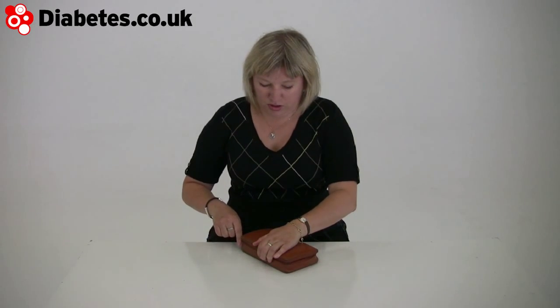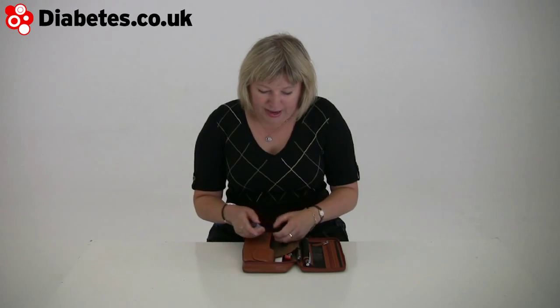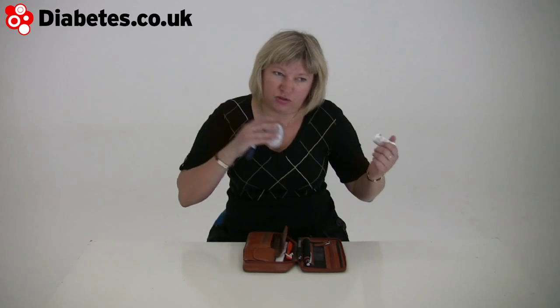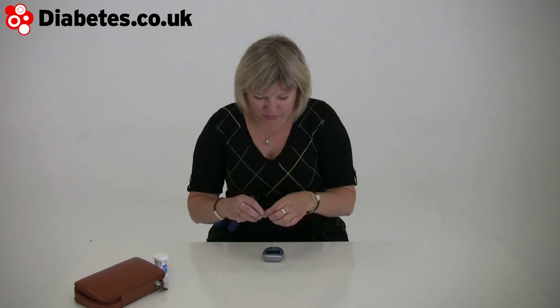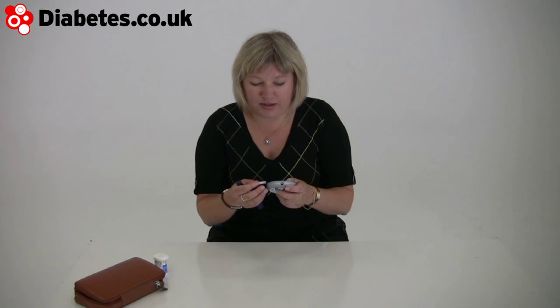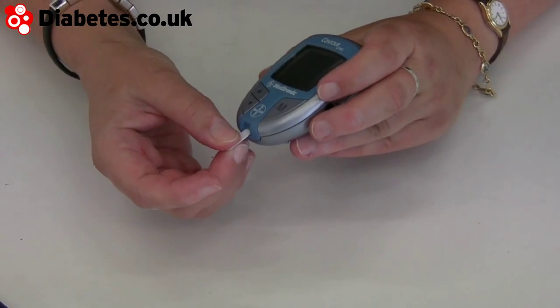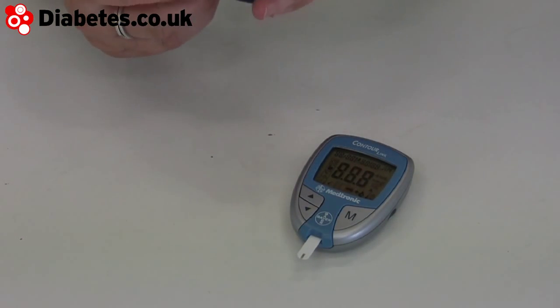One of the blood test machines I wanted to show you is the Contour Link. I'm on a Medtronic pump and as it happens this talks to the pump, so it takes out an action — you don't have to write it in a diary. It squeezes across through the joys of infrared. Strip into the Contour Link finger prick.